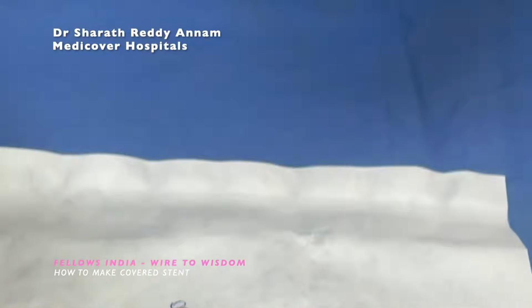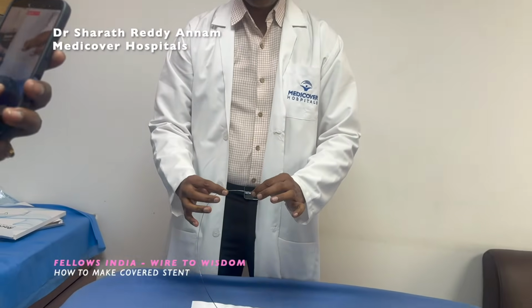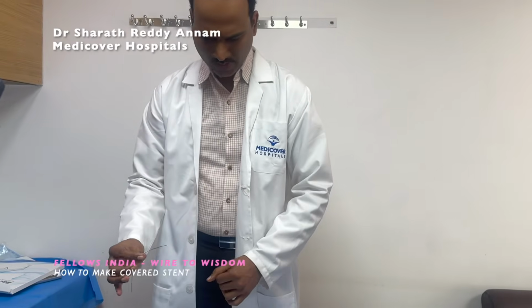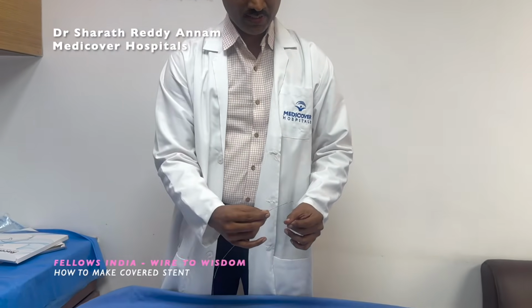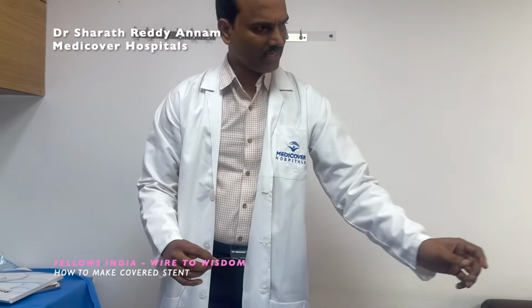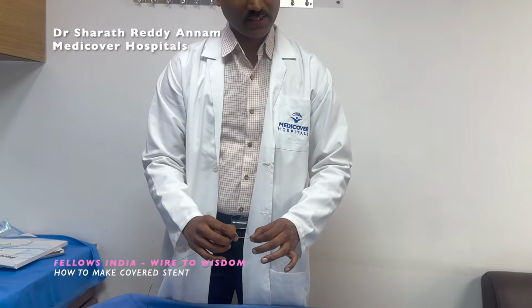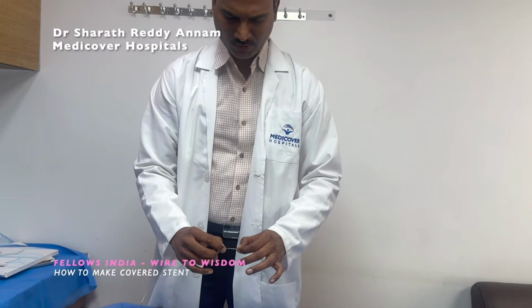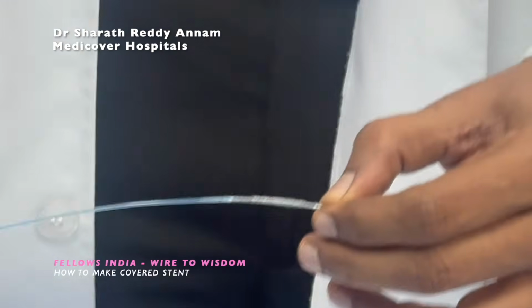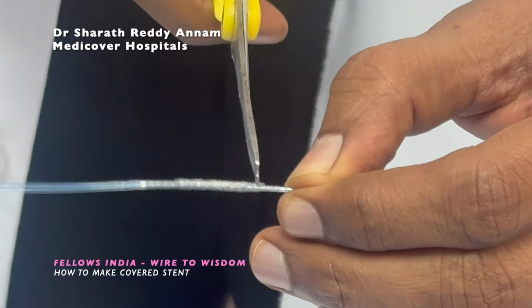Now the covered stent is done for us. So this acts as a covered stent. You can introduce this on your PTCA wire, and you take it to the target lesion where you want to deploy. But what you have to make sure is that the covered portion is only the outer stent.